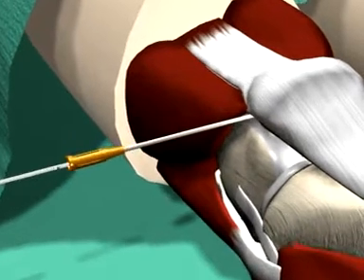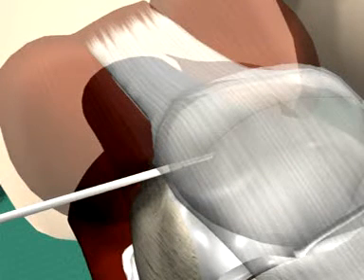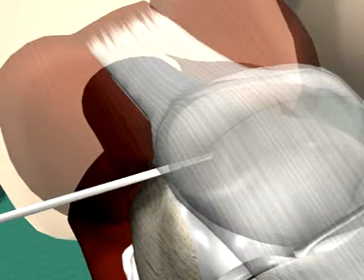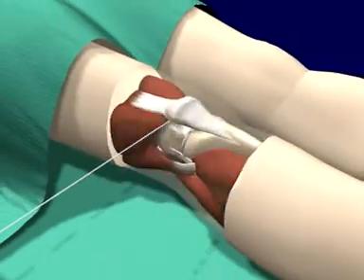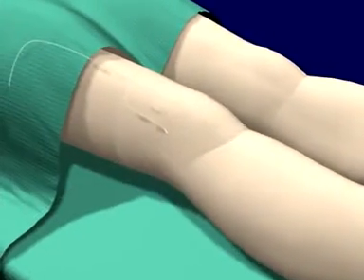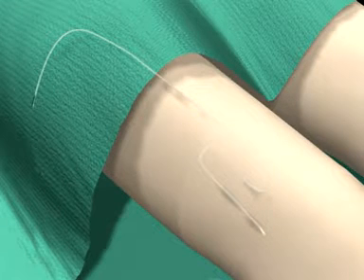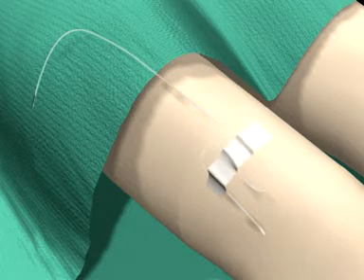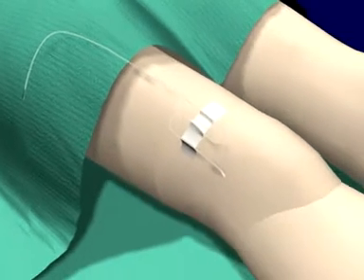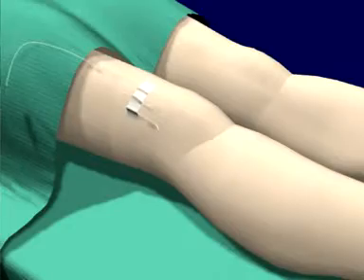Next, insert the marked end of the 16-gauge catheter through the hub of the insertion catheter and into the wound site. Remove the insertion catheter while holding the catheter tube tightly in place. When using the multi-port catheter, all catheter markings should be below the surface of the skin. Next, assure the catheter placement in the wound site by strain relieving it with any appropriate tape or dressing.